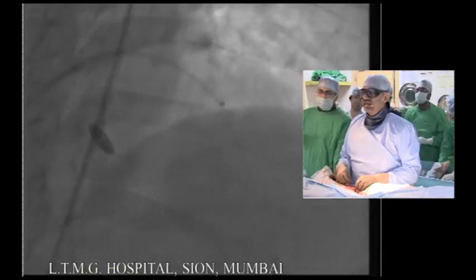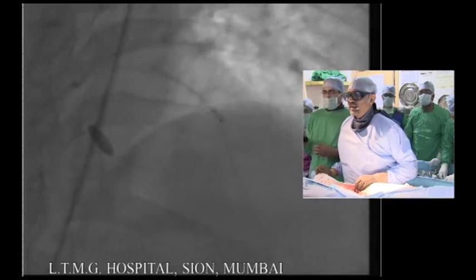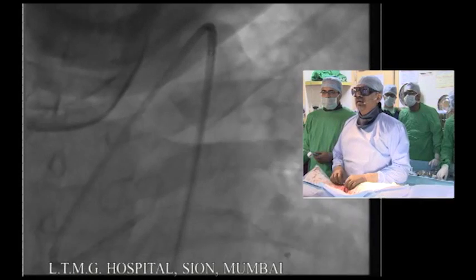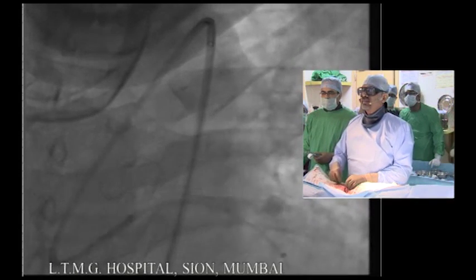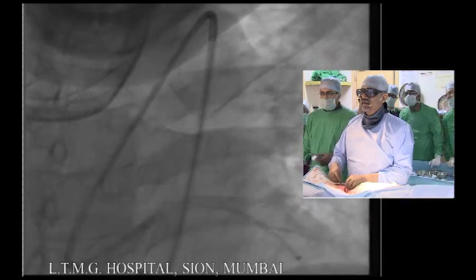So the most important thing is you have to see the entry point. Show me the entry point of the guide liner. Entry point of the guide liner. Okay. So how the stent enters from this, that is the important thing.